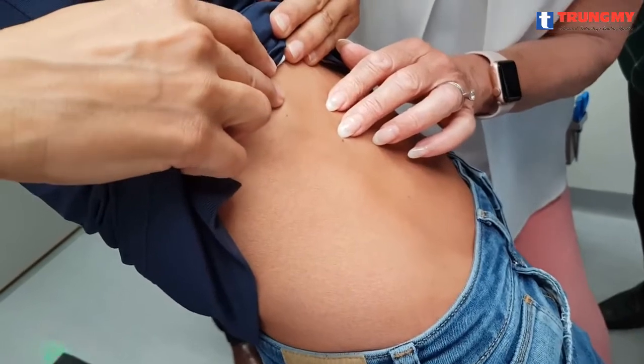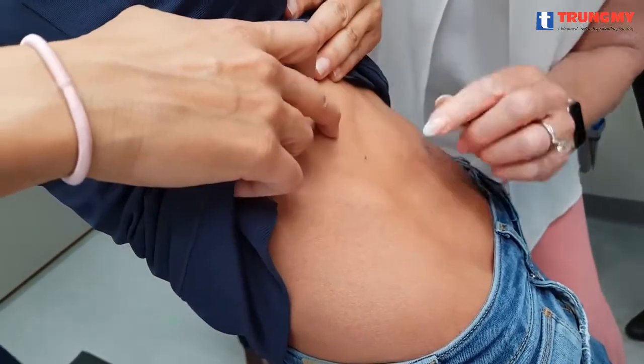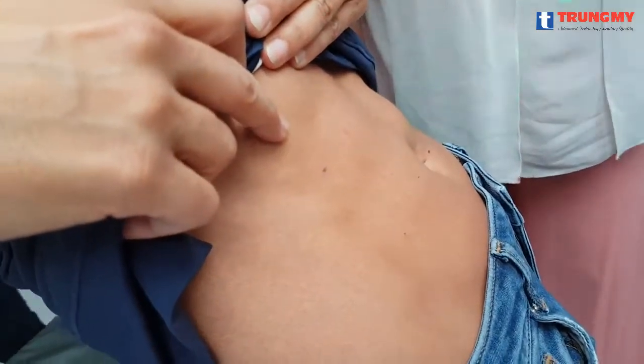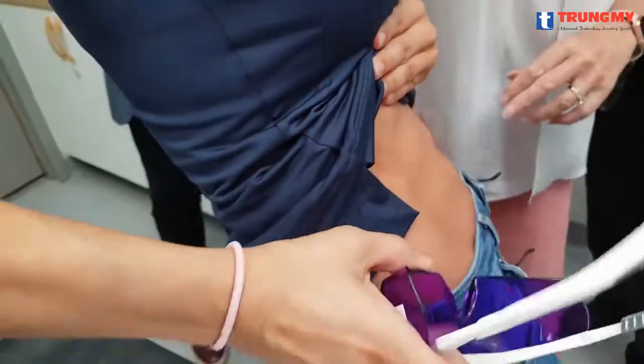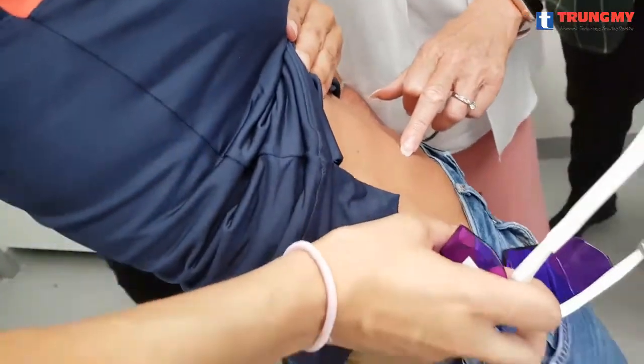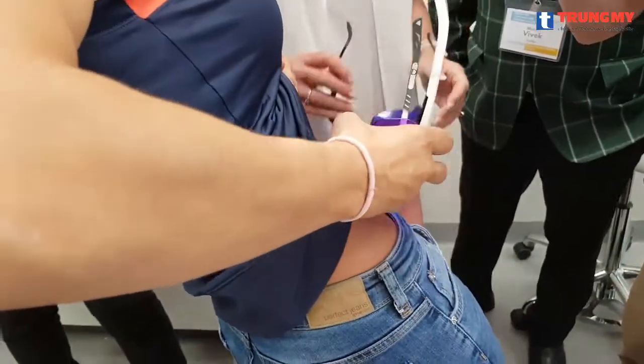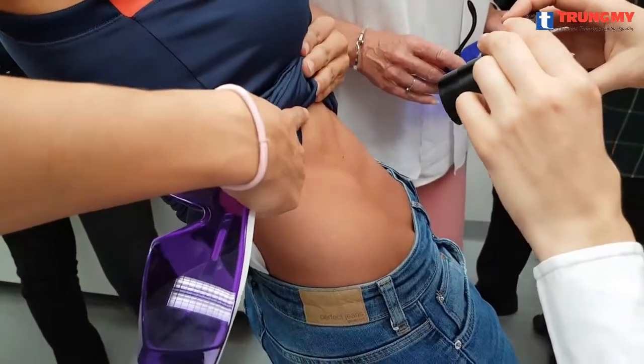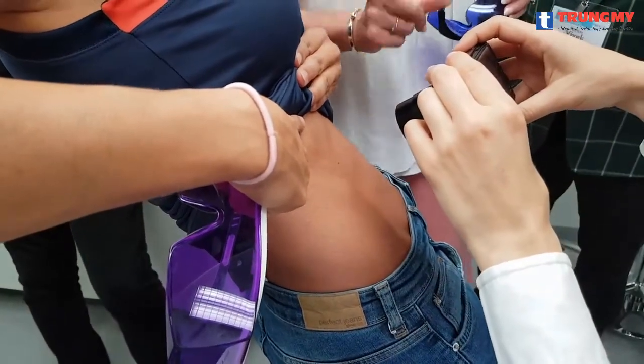And it coagulated nicely. It's blue. Little reactive erythema around it — that's not a problem. It's because I like photography — you need to keep the camera still. So you need to keep it on always. This one we take with YAG laser. So you can try it tomorrow if I have the YAG, and you can try it. So, enough coagulation.